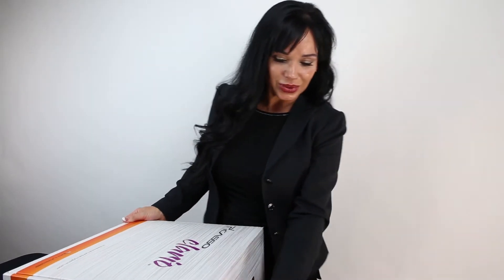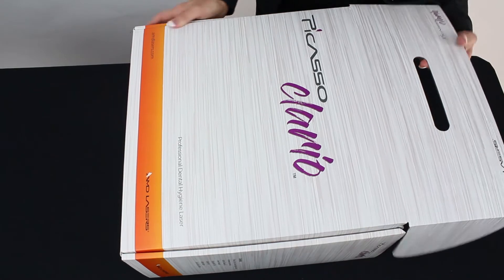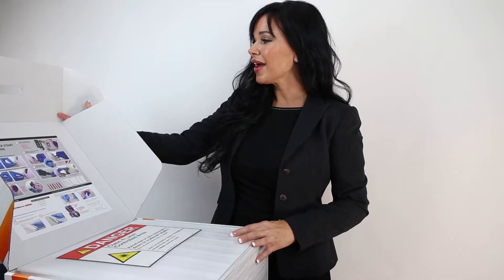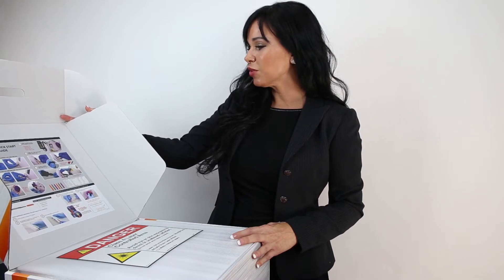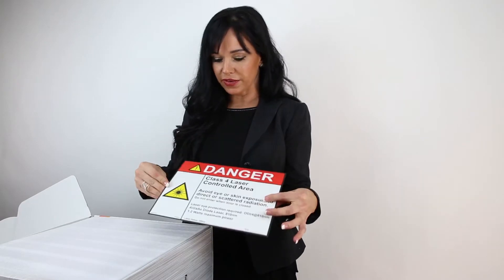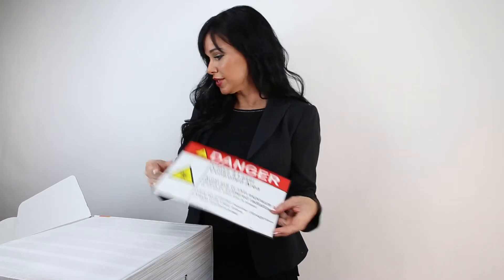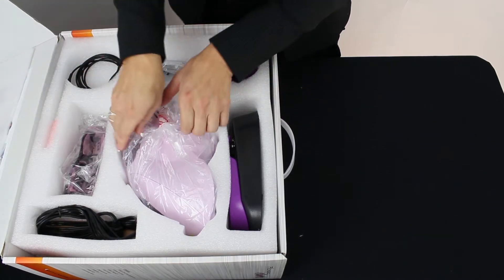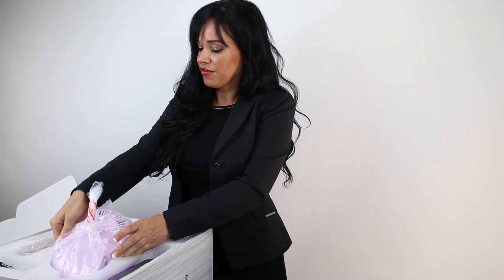Here we go. We have our quick start guide, super easy setup instructions, and a sign letting everyone know in the office that a laser is in use.